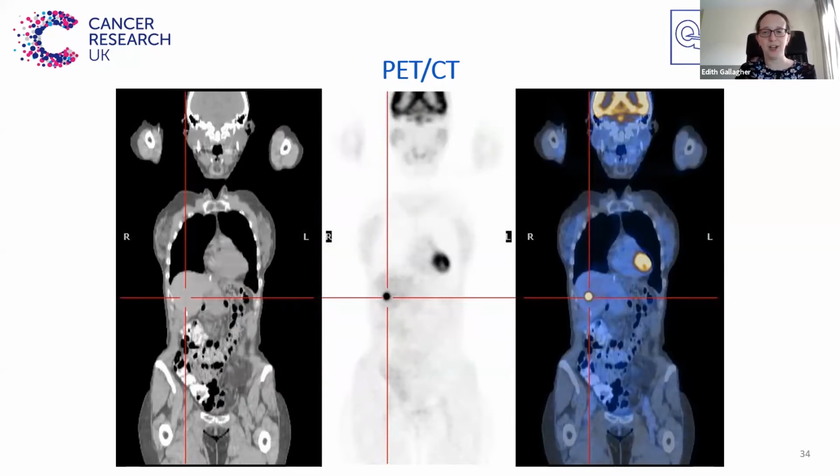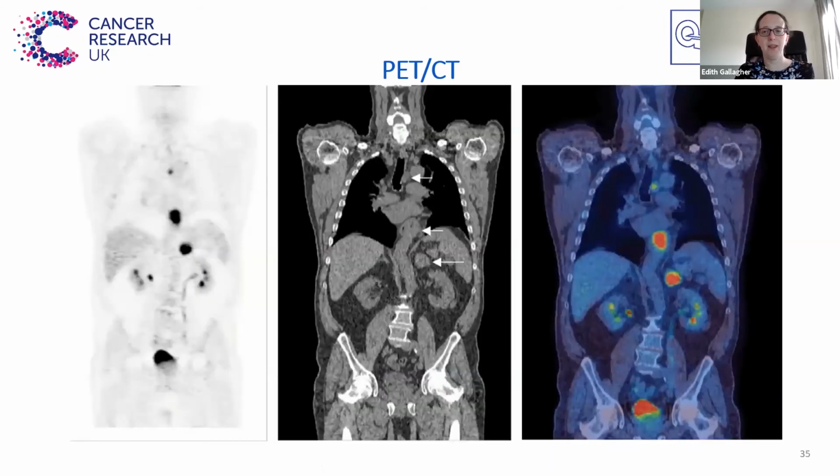As I mentioned before, it is important that the patient remains as still as possible for the duration of the scan, as any movement can lead to difficulty in fusing these two images together, and at worst, having to repeat parts or all of the scan.